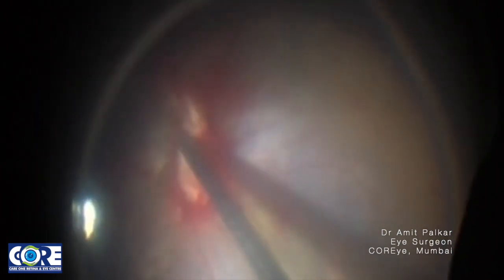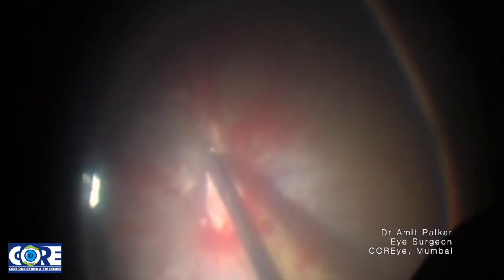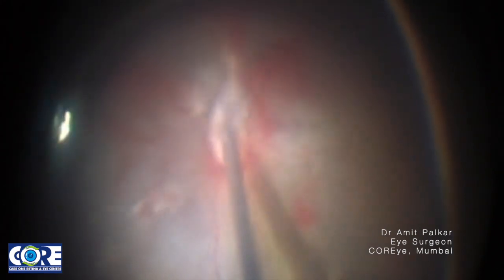Patience is a virtue when we are dealing with such membranes, and it takes time, but it's quite satisfying to cut these membranes and achieve as much anatomical success that is possible.